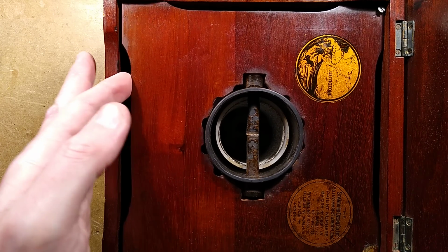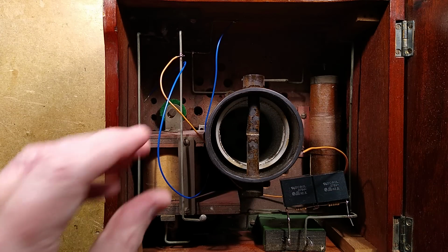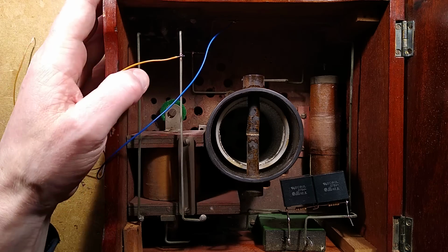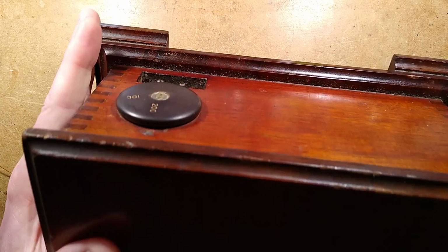If you open it up further by removing the screws, it reveals some new wires that I've stuck in for test purposes, because this thing is designed to operate at a couple of voltages. Let me show you the side of it. Lots of moving about here.